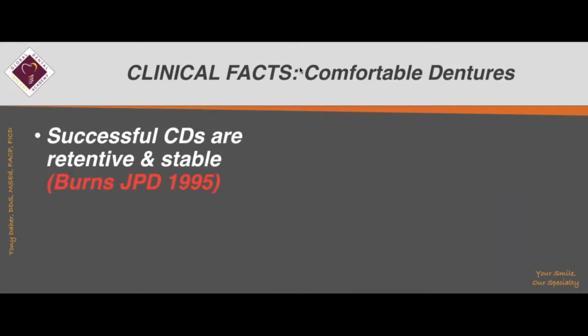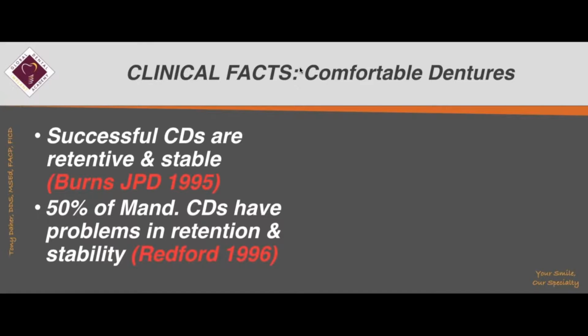Dr. Burns in 1995 told us that successful complete dentures are retentive and stable, and I'm sure you know about that. On the other hand, Redford surveyed denture wearers and found that 50% of them have problems with their mandibular complete dentures, mostly related to lack of retention and lack of stability.